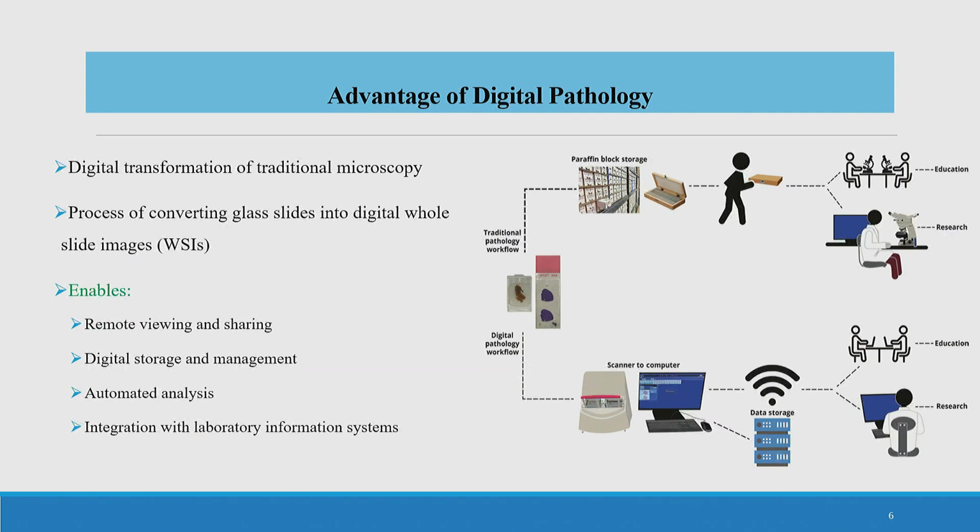Also, one drawback of the diagnosis of the tissues was that we could only analyze the cancers under the microscope. For example, if the pathologist is not well abreast of the diagnosis process, if his knowledge is not up to the mark, the diagnosis may be different, and he may diagnose wrongly.